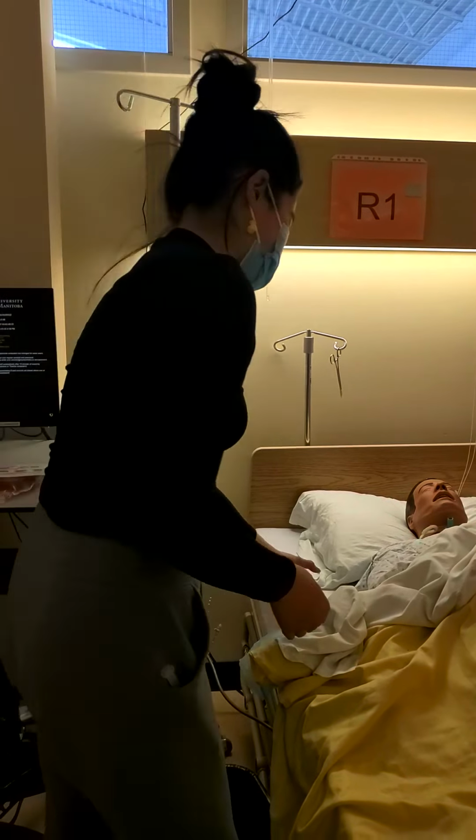And I'm going to be priming with the 250 normal saline. So we're going to maintain sterility. Spike. And then we're going to spike the bag. Okay. Making sure not to make it complicated or anything. I'll make sure that it's clamped.